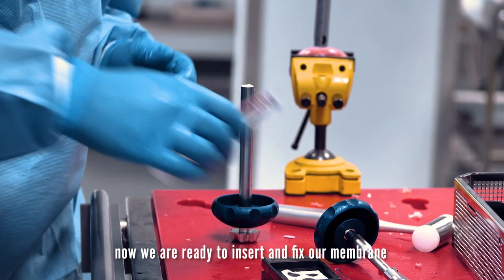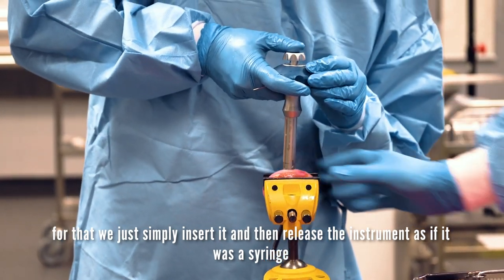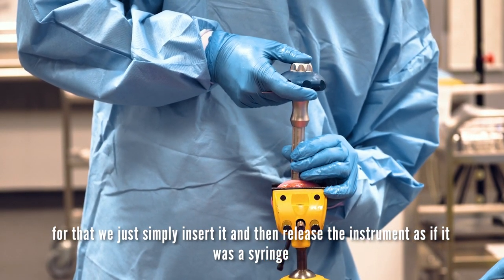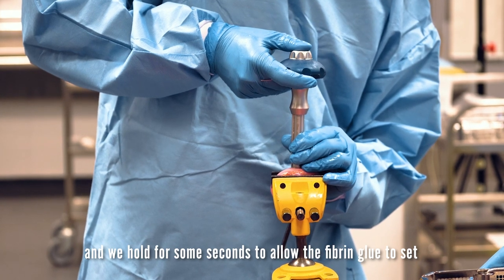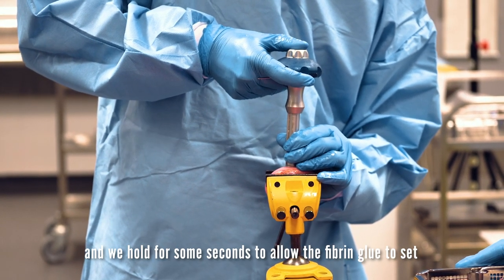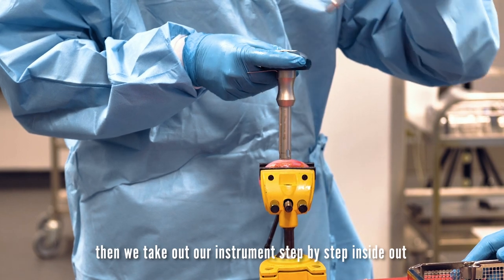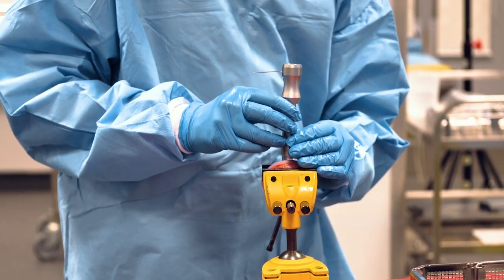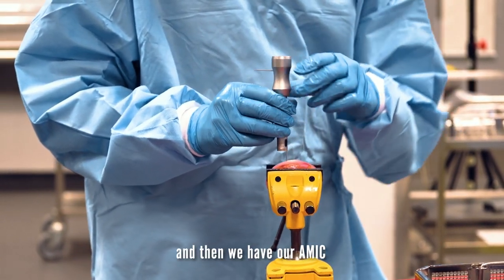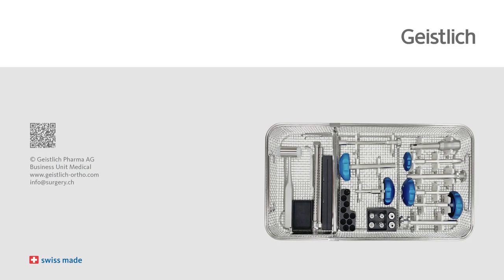Now we are ready to insert and fix our membrane. We simply insert it and then release the instrument as if it were a syringe. We hold it for some seconds to allow the fibrin glue to set. Then we take out our instruments step by step, inside out. And then we have our AMIC — arthroscopically done with the AMIC arthroscopic instruments.